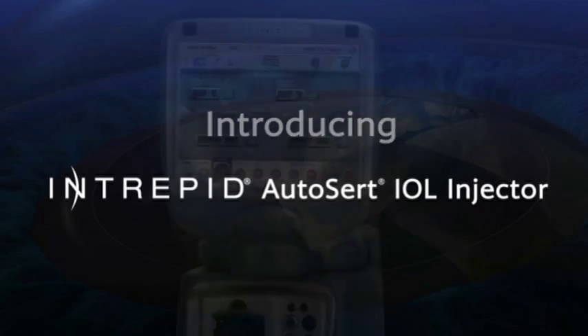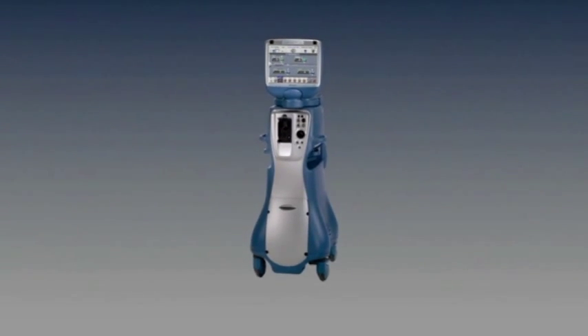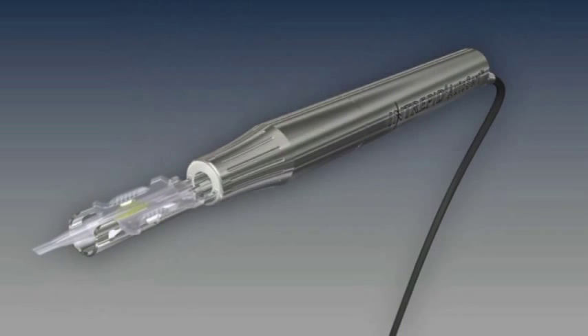The Intrepid AutoSert IOL injector is a new Infiniti Vision System innovation designed to bring advanced technology to enhance surgeon control during cataract removal with IOL insertion.